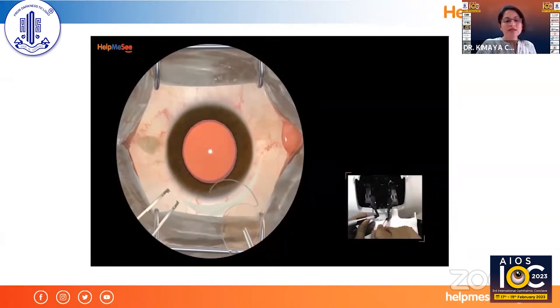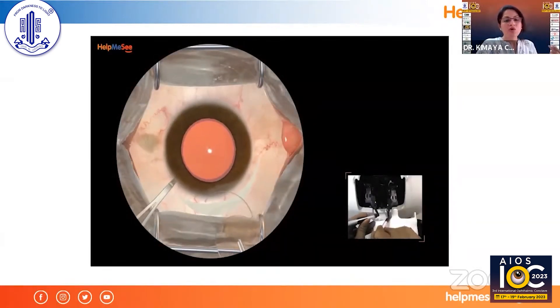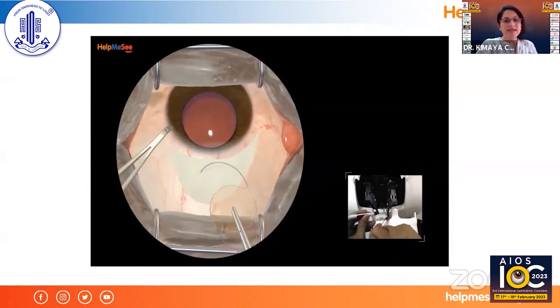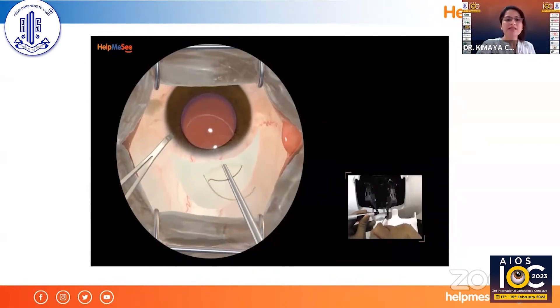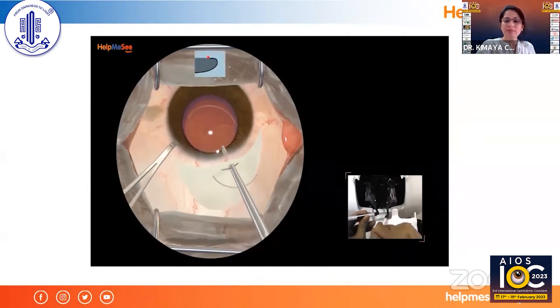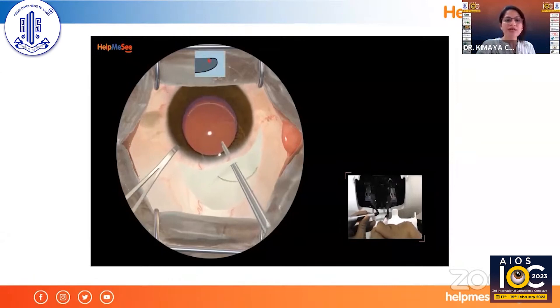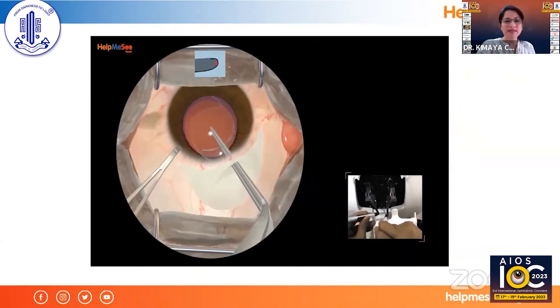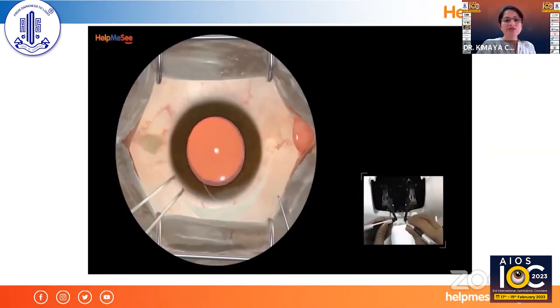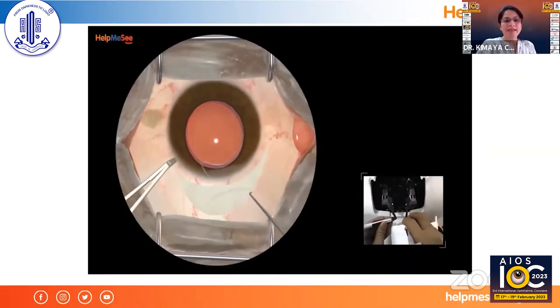For IOL insertion, while going in you have to stabilize the eye and press the posterior lip — you can feel the same resistance of the posterior lip. Go inside, place it under the capsule margin where it sits beautifully, and then use sinski to dial it into position.